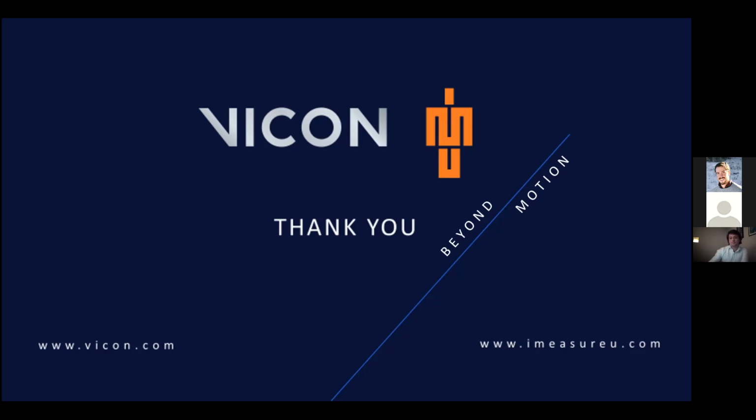Great. And the second question from that attendee is, as far as I know, IMUs have a drift, which is more pronounced for position estimates. Is this somehow corrected in Vicon? Well, there are many sources of drift in IMUs. If we're talking about global angles here, it could be things from within your current environment. It could be magnetic objects, or any sort of metal which distorts a magnetic field. Obviously, the global angles use the magnetometer as part of the calculation, so if you distort that, then you get some drift in your sensor. There will be some drift over time as well.